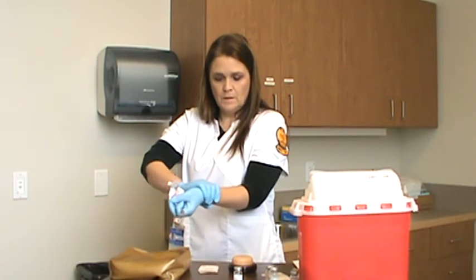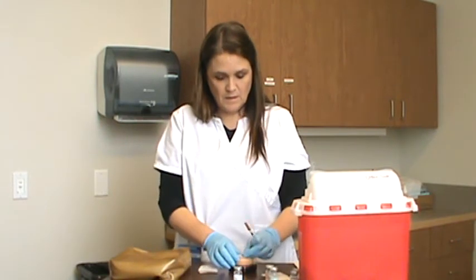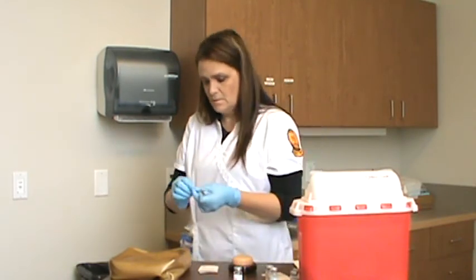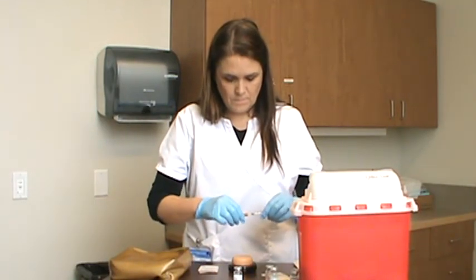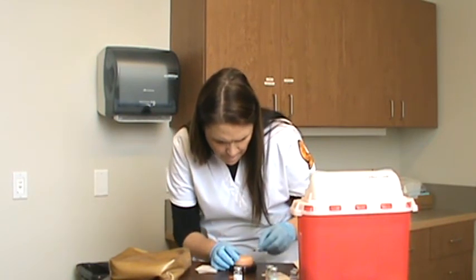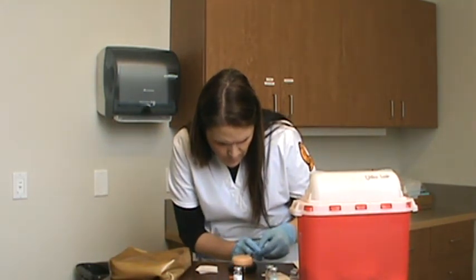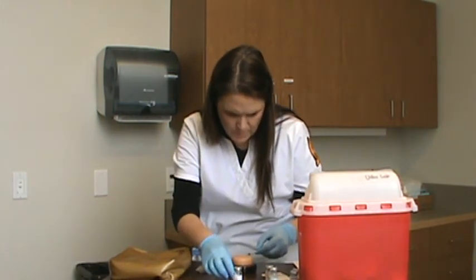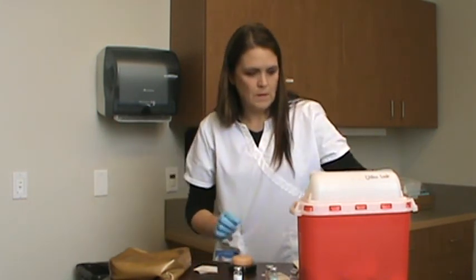And the TB goes right here on your arm. It's a hand's breadth from your wrist and your elbow, so it's a really small window, just right in there, and it is at a 12 to 15 degree angle. Okay. Just right in there. And it creates a little wheal on their arm, so you know you've got that in there. Okay.